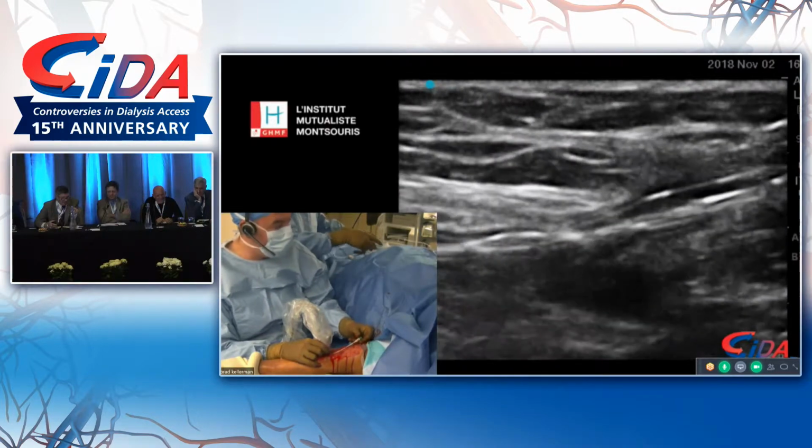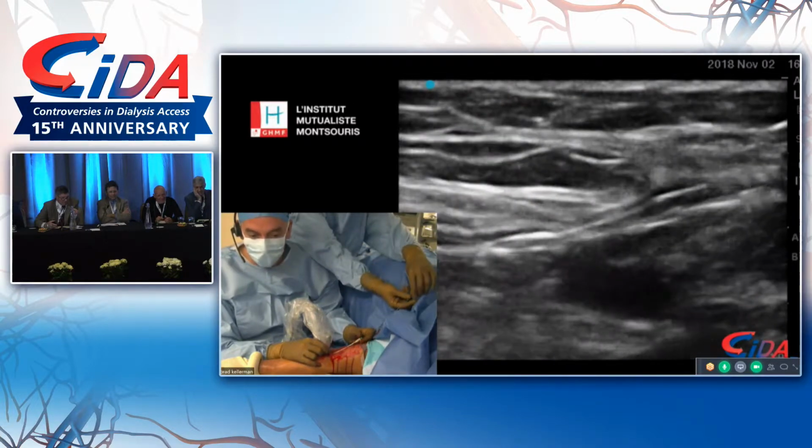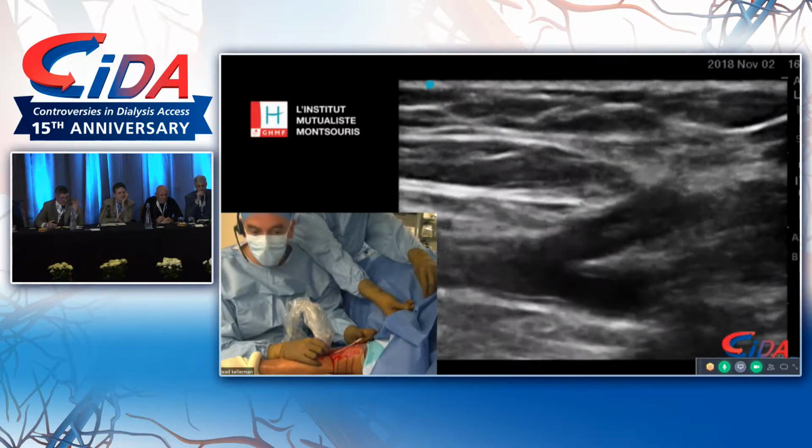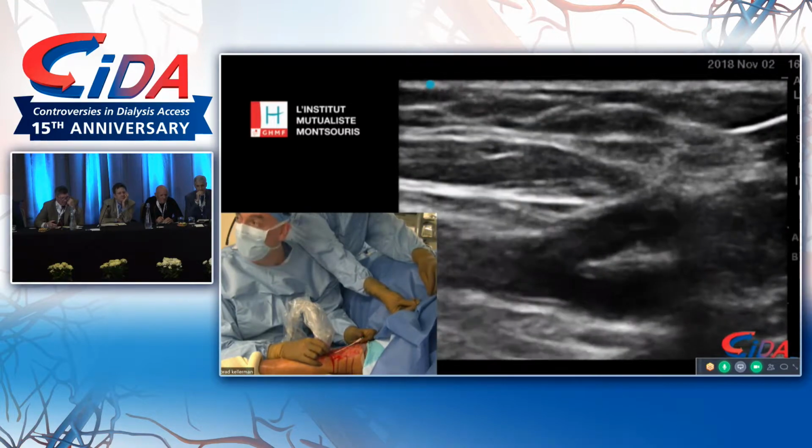Hi, Jeff. How calcified of an artery will you tolerate? If you see medial calcification in the artery, when do you back off? What's the kind of boundary?